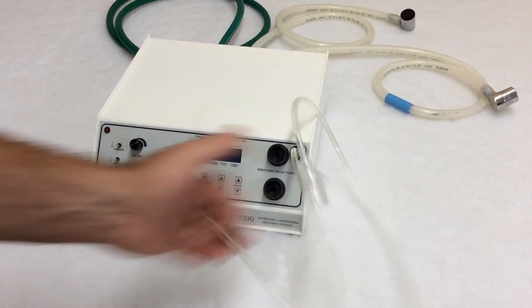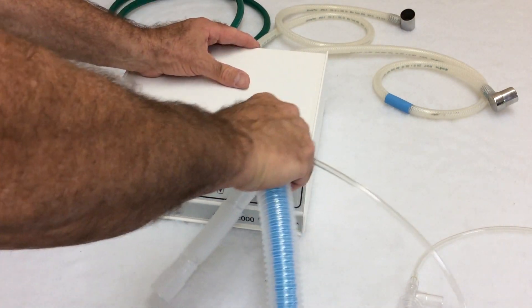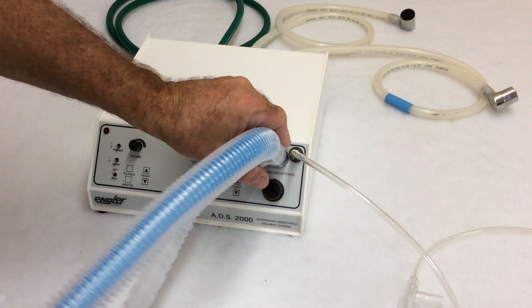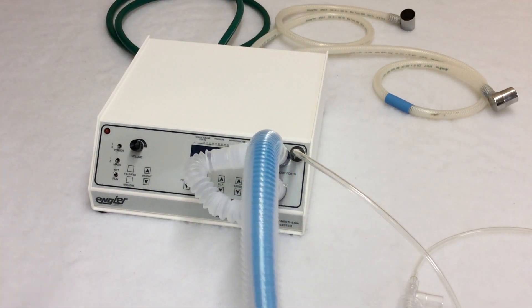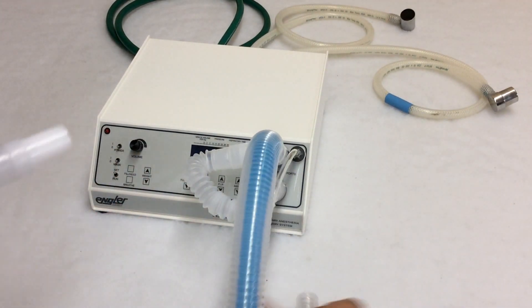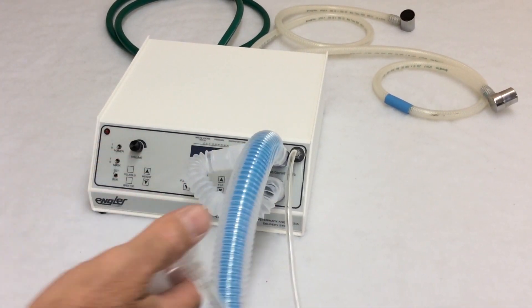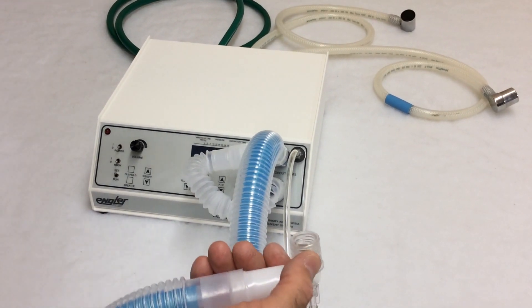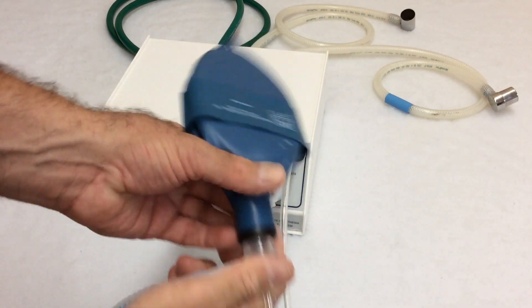Next we have the breathing circuit — it's a Unilim Bain circuit. The inspiratory goes on the top, the expiratory goes on the bottom. This would ordinarily connect to your breathing circuit and your endotracheal tube, but in this particular case, we're going to use a test lung just for demonstration purposes.